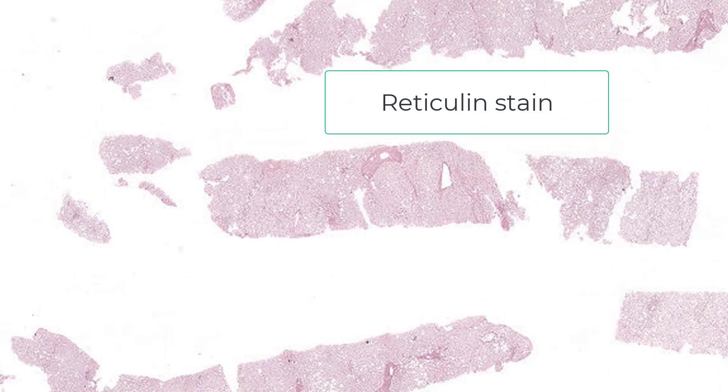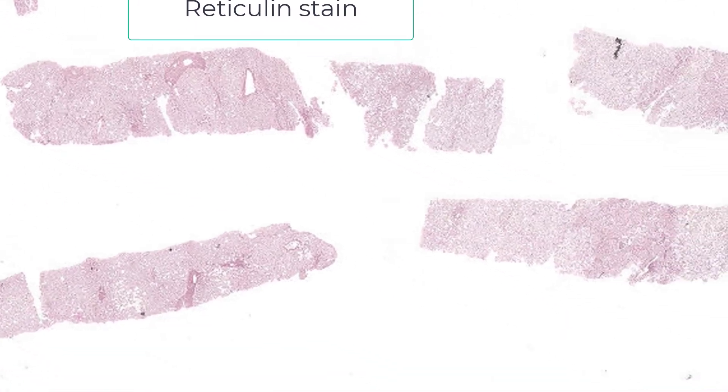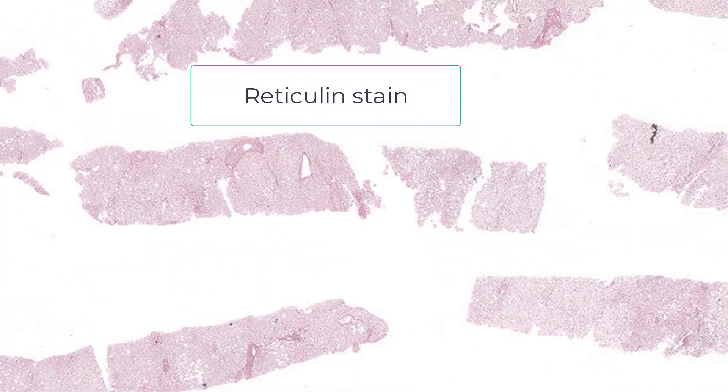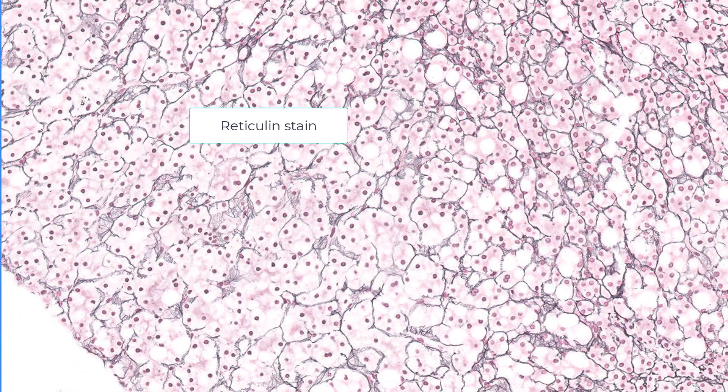Even though I think this is probably benign, I almost always get a reticulin stain. You can see it is intact in the adjacent liver, but it's also intact in the adenoma. I know it's somewhat hard to see at very low power. Here's a higher power view — you can see that virtually all of the cells are encased by these reticulin fibers. You often see loss of reticulin fibers when you see fat, but if you have very little fat like this, the reticulin framework remains intact.